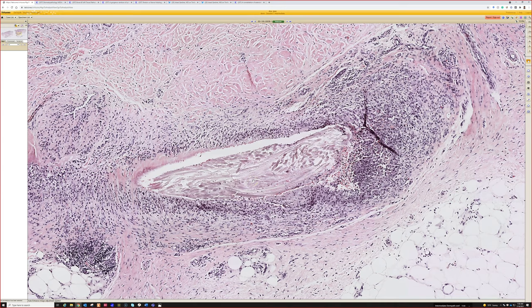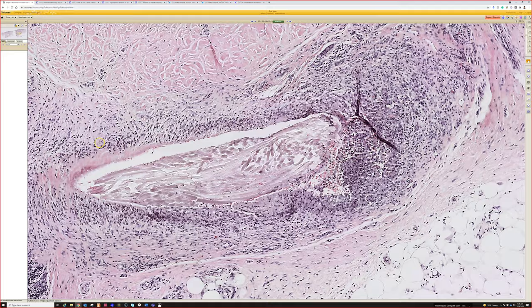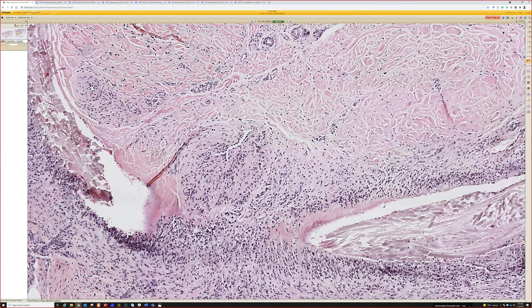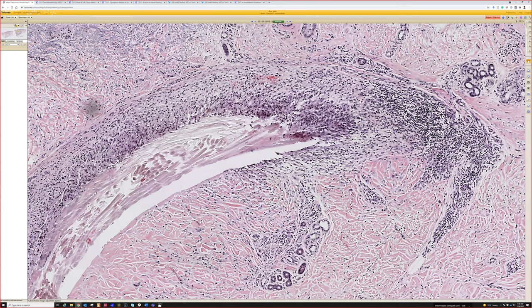The first time I saw this I had no idea what it was. But this is likely suture — like Vicryl — because it has this braided appearance cut in cross-section. This is a braided synthetic suture, surrounded by kind of palisaded granulomatous foreign body reaction and inflammation. The body does not like foreign stuff, including suture, and it tends to continue to attack it and surround it with granuloma and inflammation.